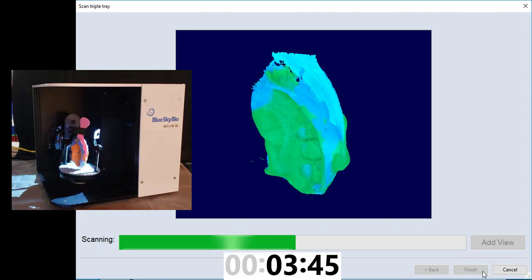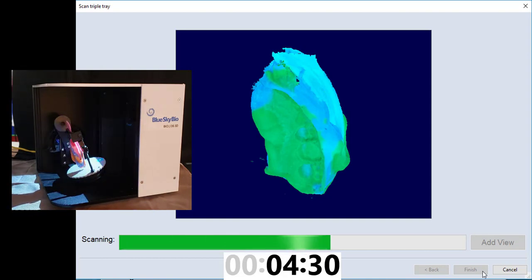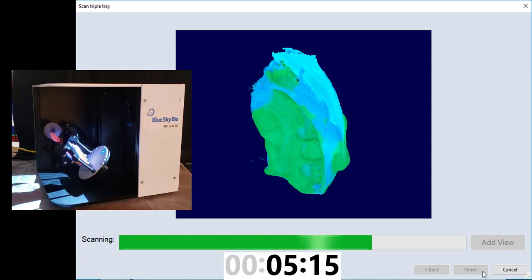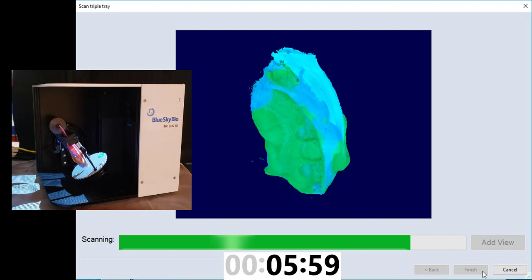It's going to capture upper and lower. It's going to separate those all on its own. So this is a very hands-free process. So even though it takes a few minutes, you don't have to sit there and babysit this throughout the scanning process. So I'll finish time-lapsing this and then show you how to export these scans.